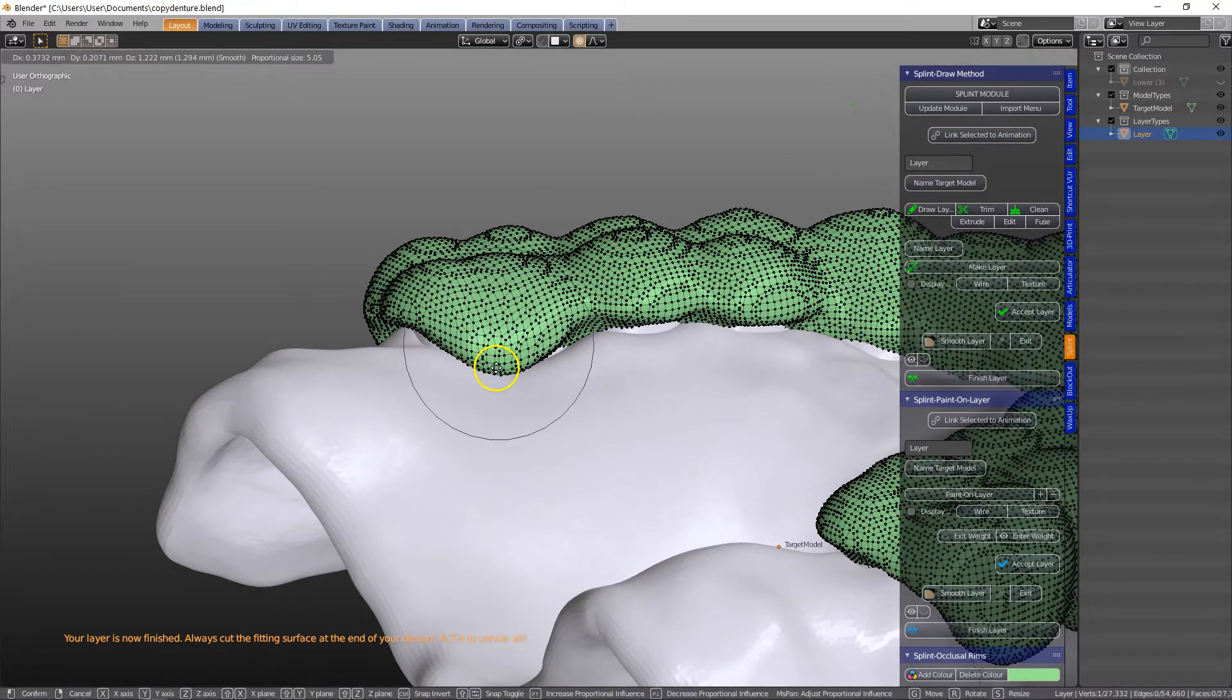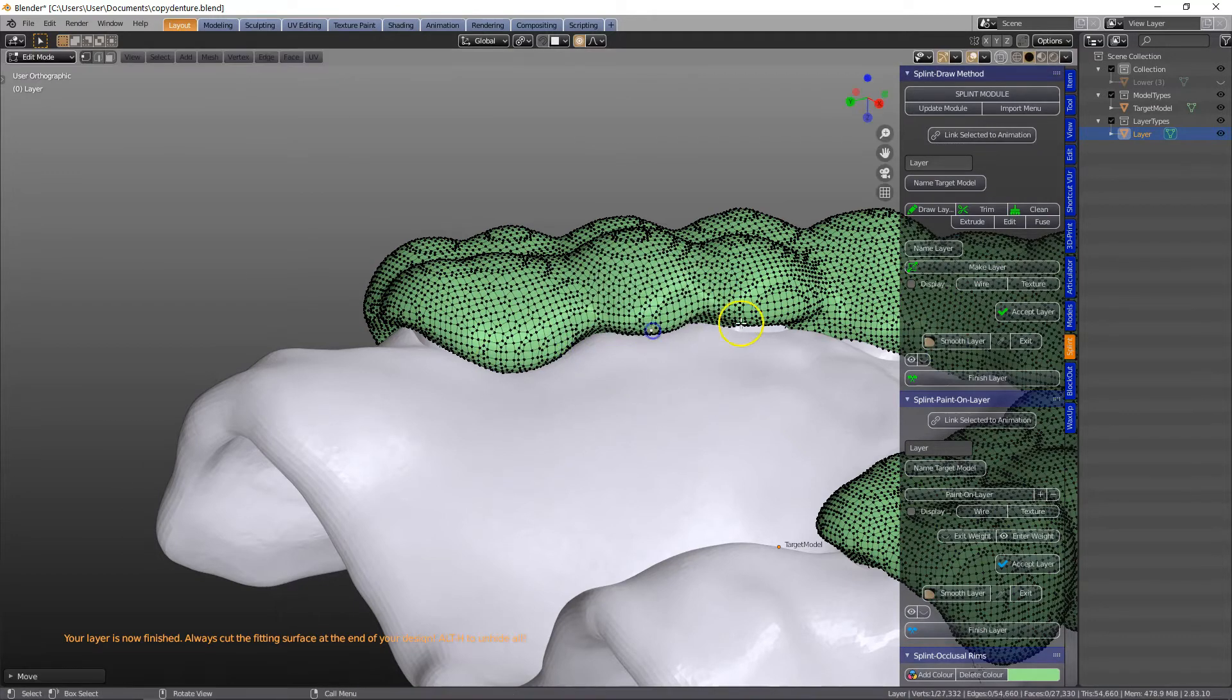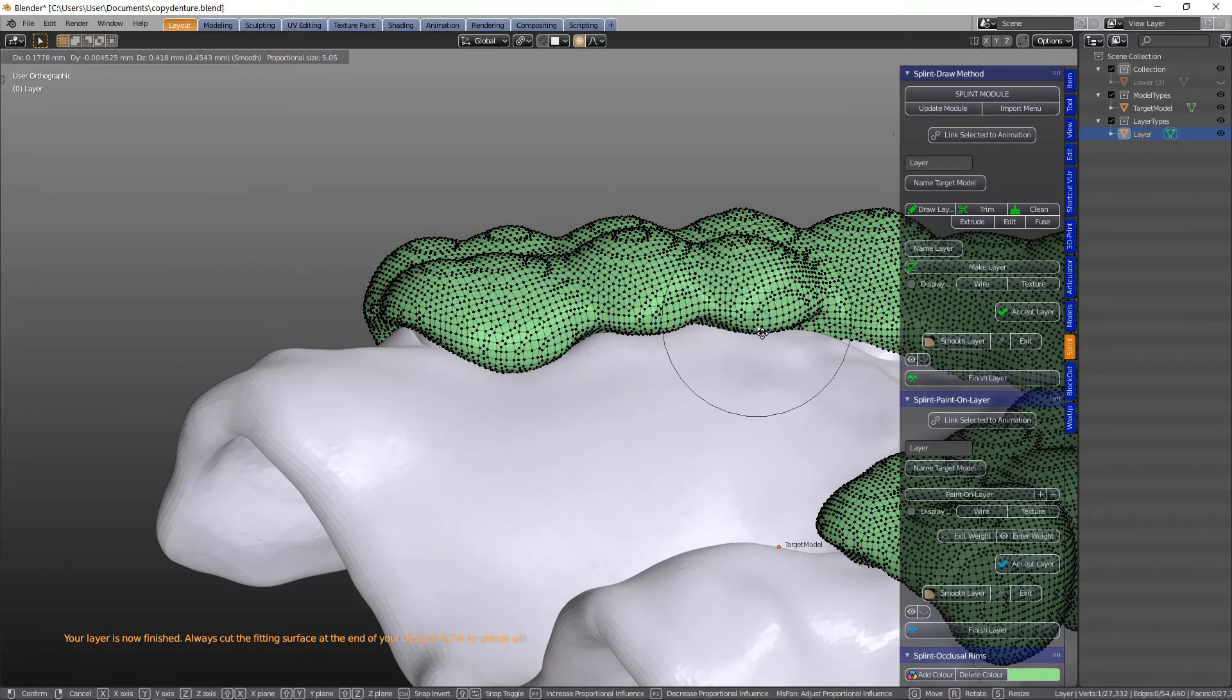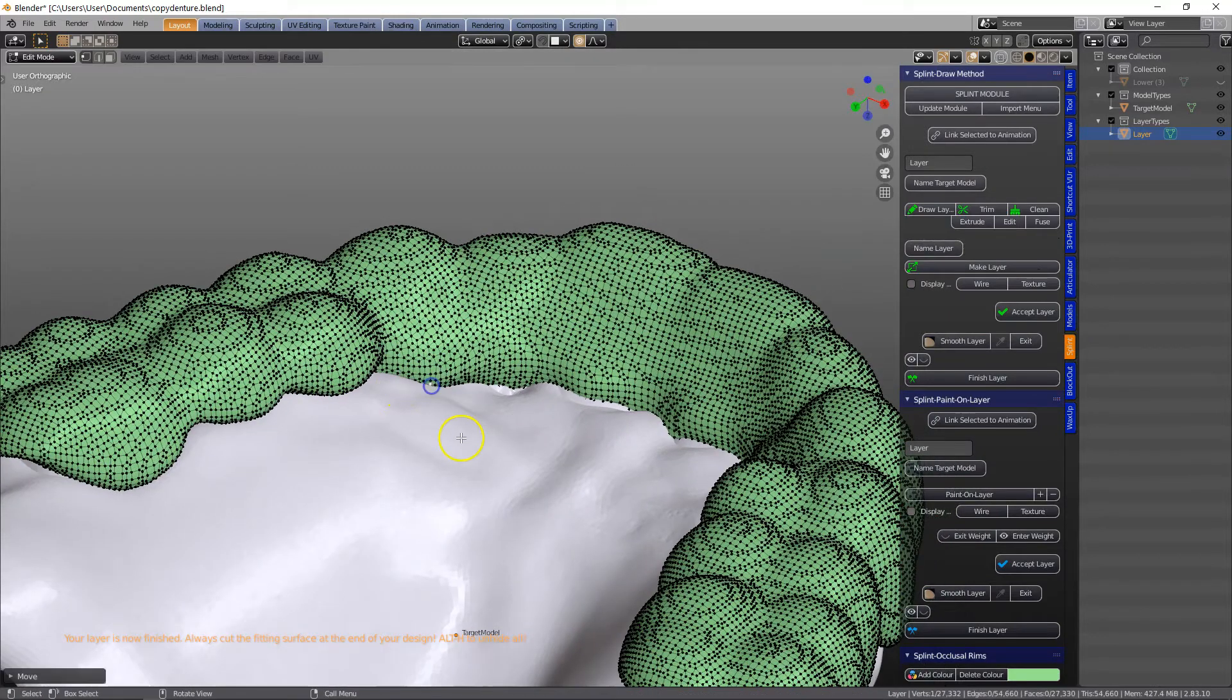Now remember this becomes your cutting tool, but we're not going to cut it, we're going to use the intersection.